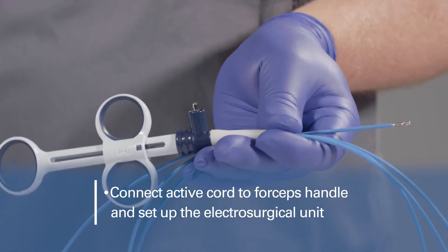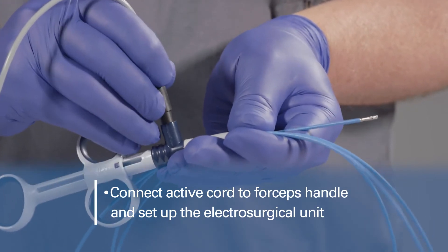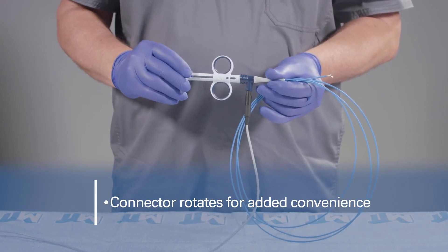Connect the active cord to the forceps handle and set up the electrosurgical unit, modality, and settings per the manufacturer's directions for use. Note that the electrical connector rotates for added convenience of use.